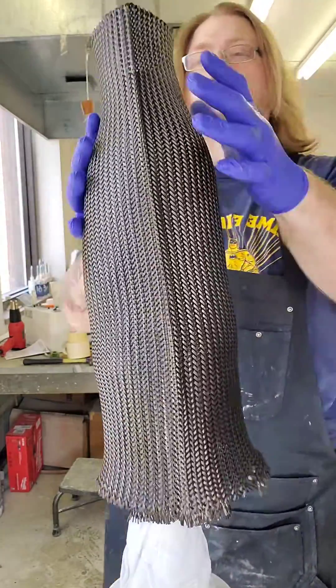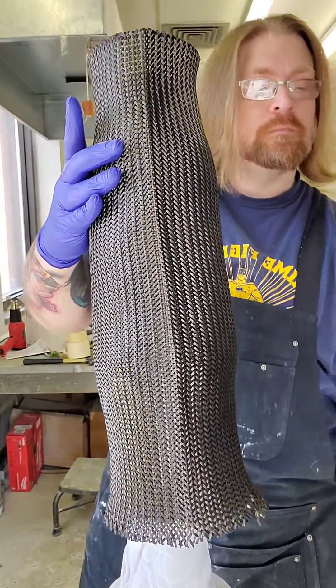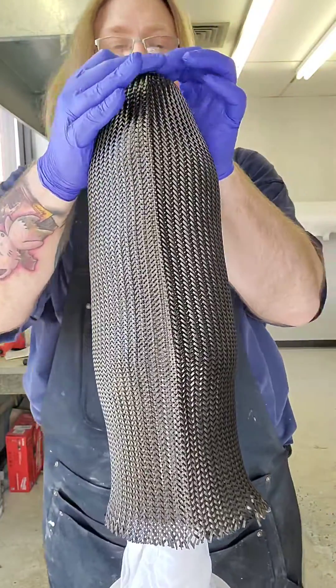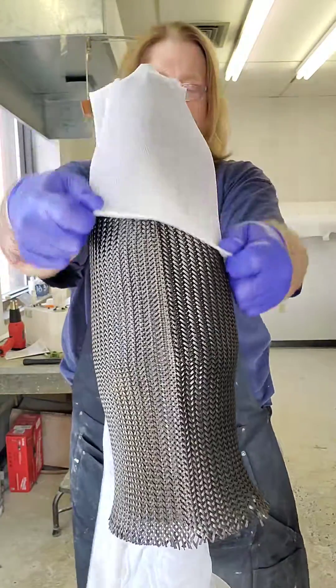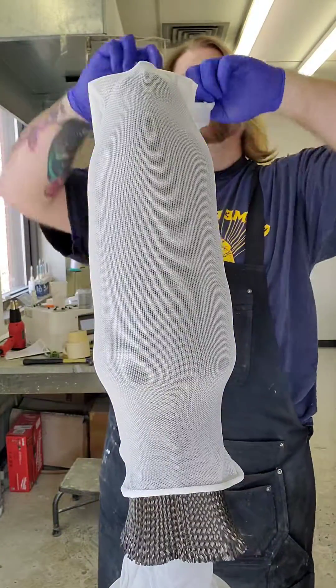After that I'll do another layer of carbon. Every prosthetic is a little different — some have more nyglass, some have more carbon. I try to keep everything about six to eight layers thick, and depending on the weight, that determines how much carbon fiber we use.